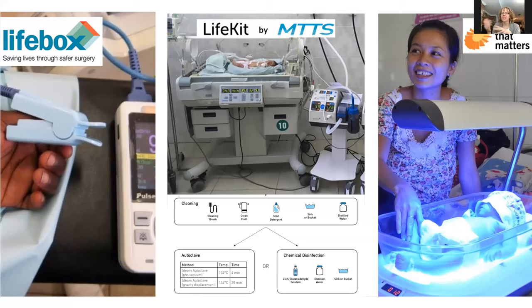And then the last example is something near and dear to my heart. When I was at Design That Matters, I mentioned that we designed the Firefly phototherapy device. One of the aspects we had to think through very carefully is the bedding. So we saw in many hospitals, initially with our field research in human-centered design in Vietnam, newborns were laying on shared beds, often with bedding or sheets that weren't necessarily changed.